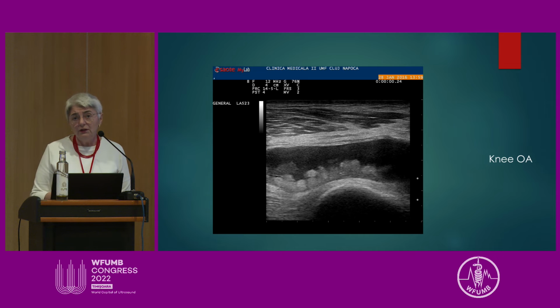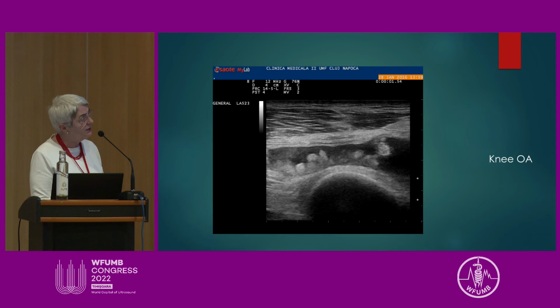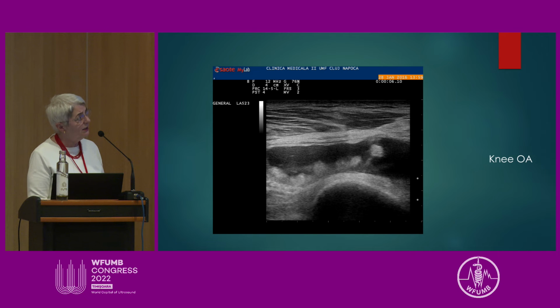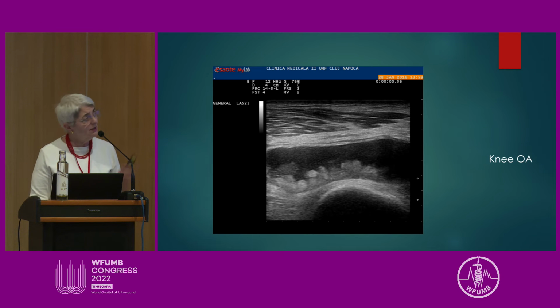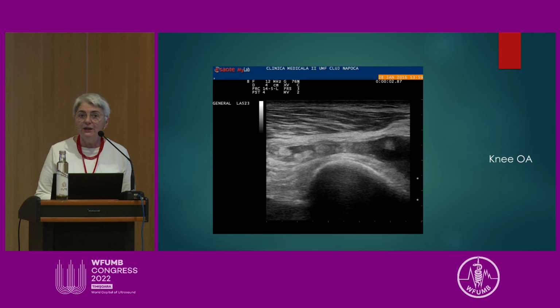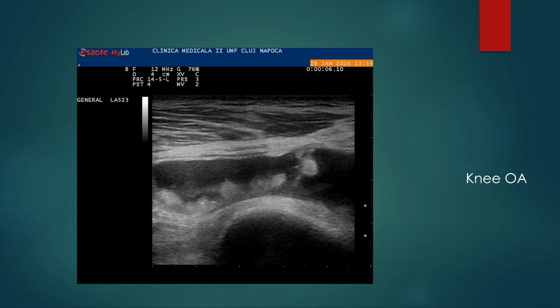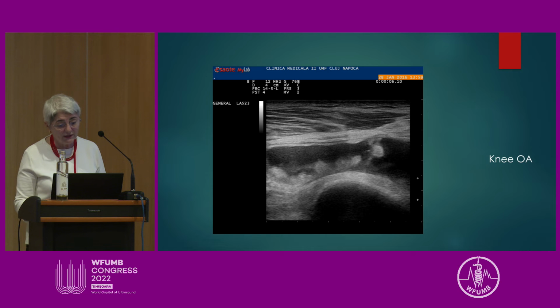We are used that in osteoarthritis to have only fluid and the degenerative process, the meniscus, bone, hyaline cartilage, but especially in the large joint, we have frequently proliferated synovia. You see how much proliferated synovia in this knee? And generally, these cases are very difficult to manage, and for the treatment we have to have imagination to treat these patients.